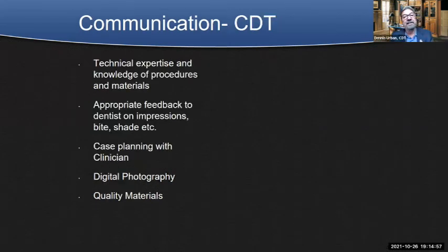And communication from us, the certified dental technicians: we depend on our technical expertise and knowledge of procedures and materials. And we give you the appropriate feedback on impressions, bites, and shades. I think the number one call we still make in a laboratory is on impressions, and then bites, and then the shade. So it's important that we do case planning with you in the correct way.